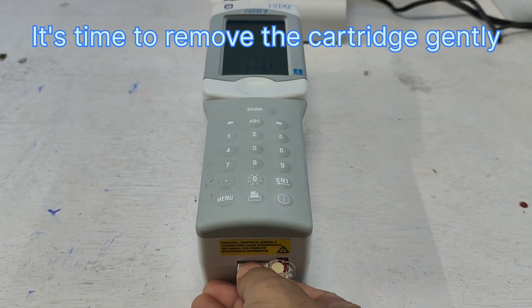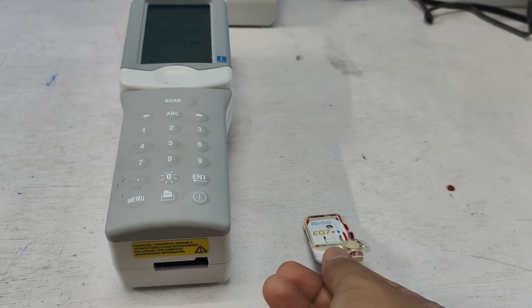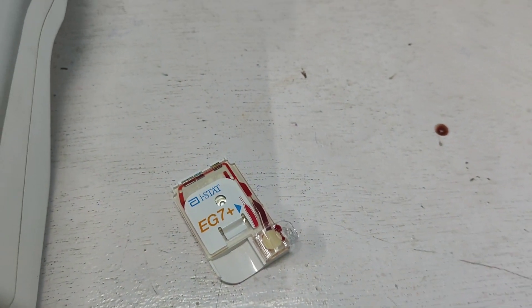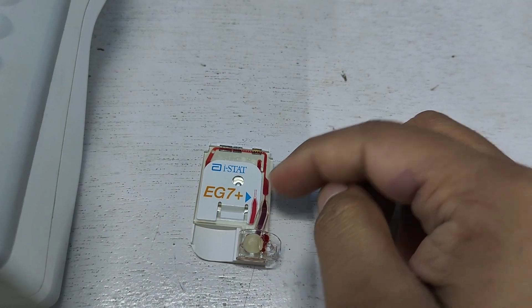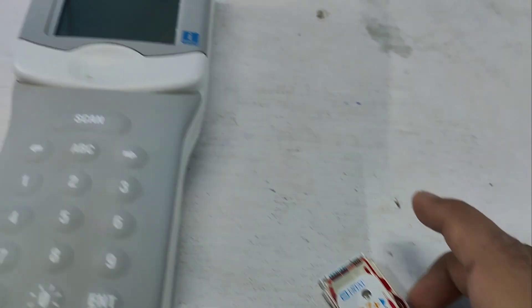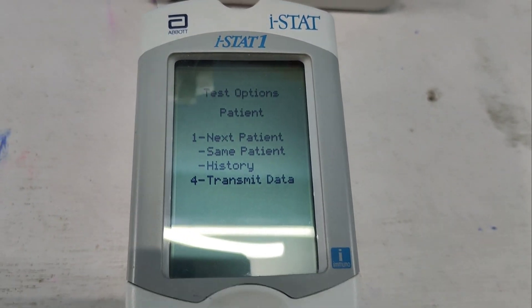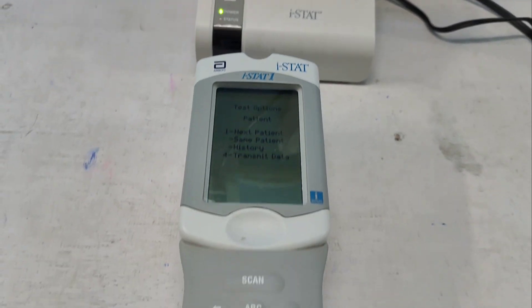I slowly remove the cartridge. You can see what happened — I poured the blood up to the mark, the blood was transferred through the cartridge, and this gives the result. The test is done.